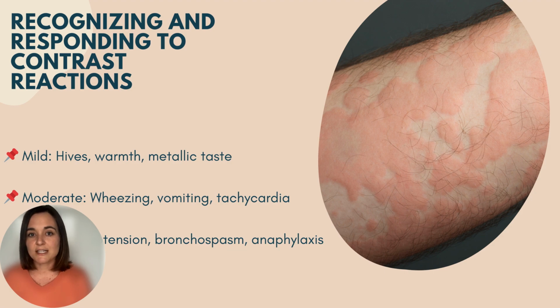Reactions are categorized into mild, which could include hives, warmth, or a metallic taste; moderate, which could include wheezing, vomiting, or tachycardia; and then severe, which could look like hypotension, bronchospasm, or anaphylaxis. If any reaction occurs, stop the procedure, call for help, and monitor vitals.